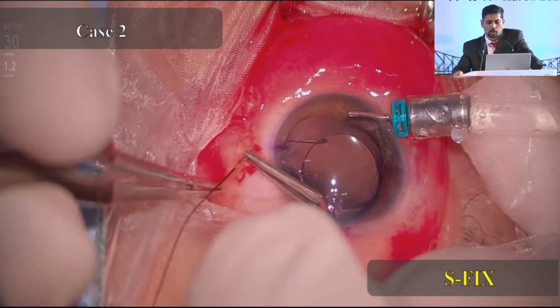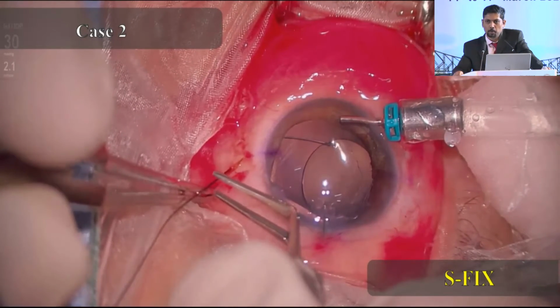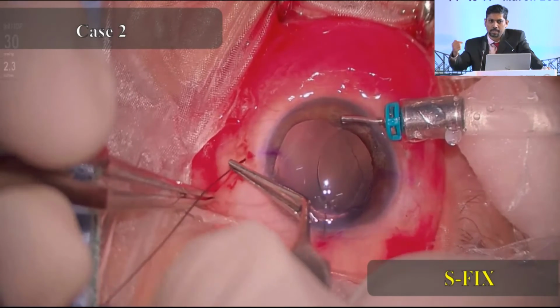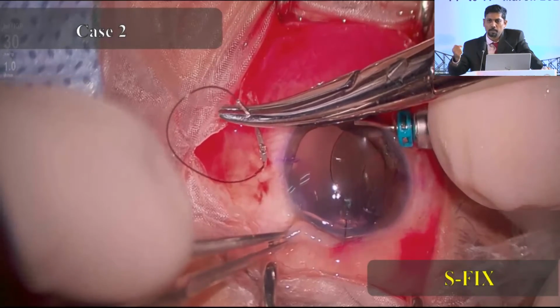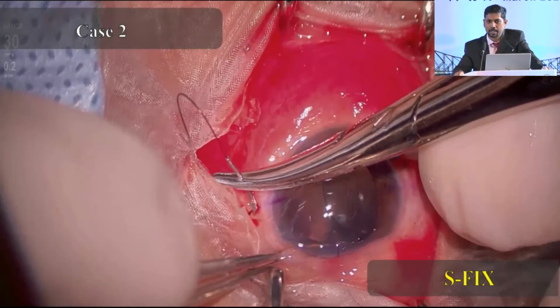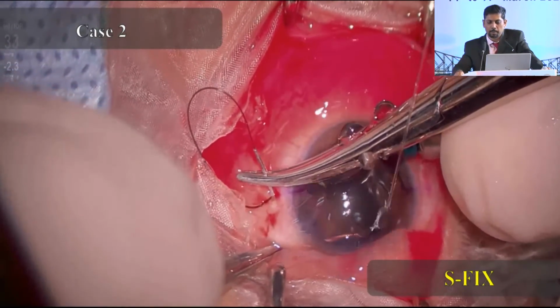So push it inside after docking. Do not worry about the IOL, it's not going to fall, because the haptics are, as you know, a curved thing and the polyamide tube is straight. So when you try to push the curved thing into a straight thing, it gets snugly fit. Also the dimensions are meticulously designed in such a way that this disengagement will never happen when it is inside the eye.